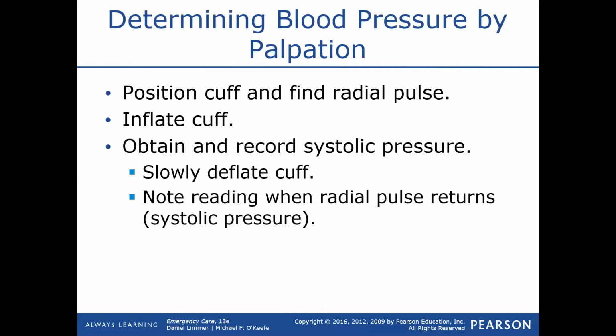All right, determining the blood pressure by palpation. This is something we don't do very often, but it is a tool that we can use to get their blood pressure. It's usually when you are in a really loud environment and you just can't hear it. You can't hear them talking, you can't hear the pulse. But we can get half a blood pressure anyways. We can get the systolic number, which is the top one. So I'll just tell you real quick how to do that.